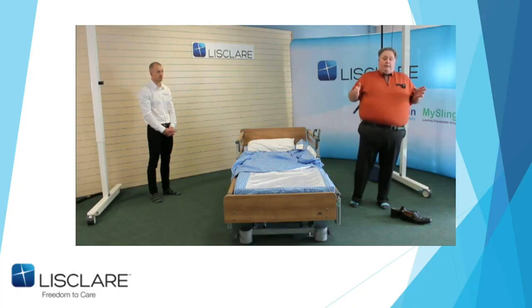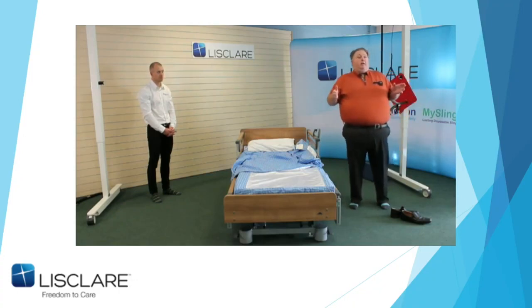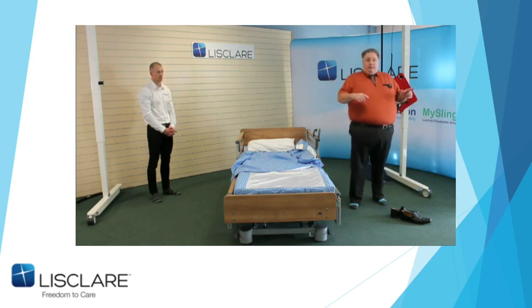First problem about a divan bed is most of them now you need step ladders to get on because they're so high. I've seen this quite a lot with clients: they've raised them up to use those standing aids, and now the poor patient can't get in or move into the centre. But we'll go to the next slide and discuss that.